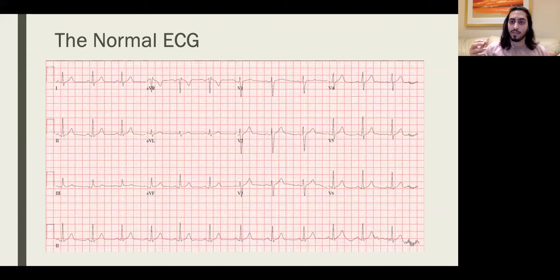What is the T wave? The T wave is the repolarization, the negative charge that's going away from the apex of the heart. So it's going right and it's going up. So it's going right towards where the positive electrode in AVR sits. So you're having a negative charge go to a positive electrode. That causes a negative deflection, because we know a negative charge towards a negative electrode would be a positive deflection.